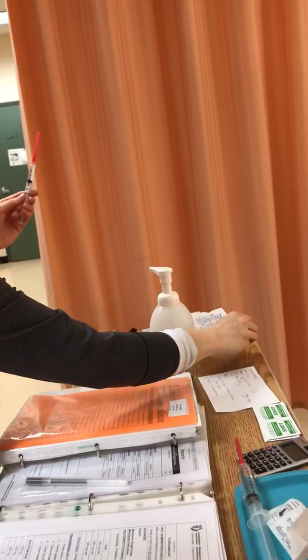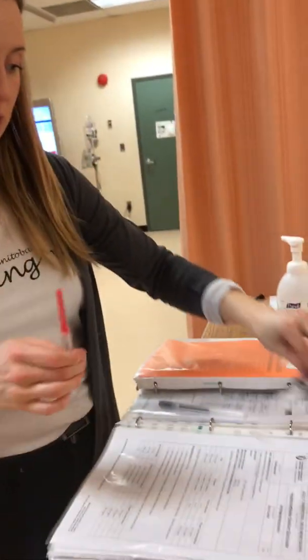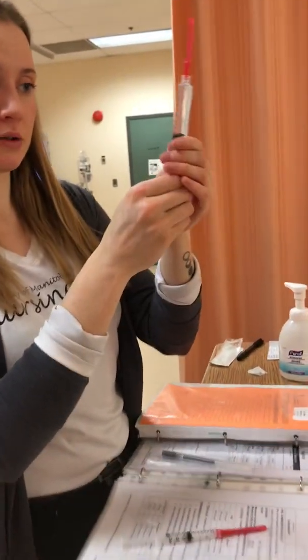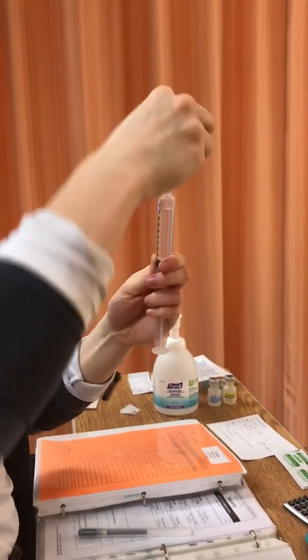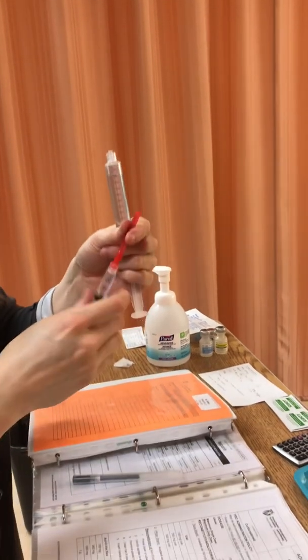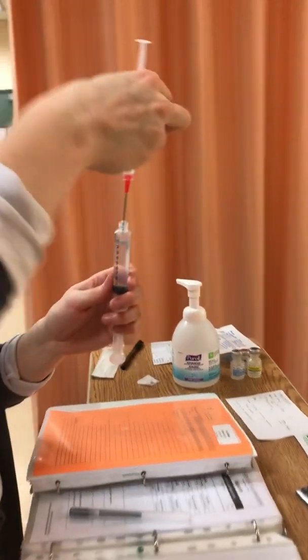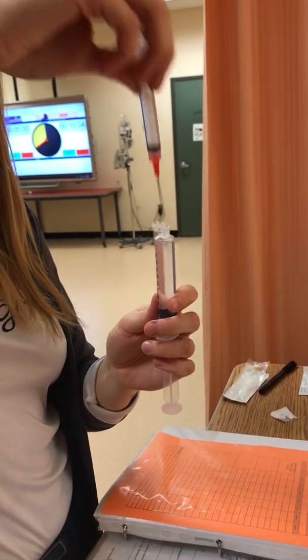So that is that. I will now put this and my sterile water and my normal saline in the med waste bin, and I will pull this down to just below 10. Remove this top, pull this up, and push the rest of this medication in.